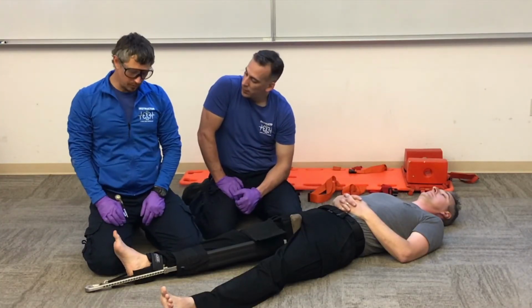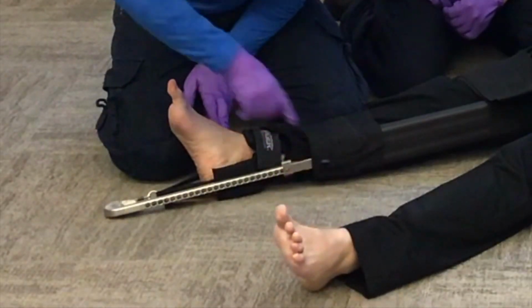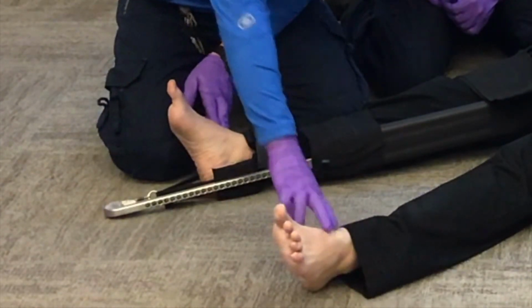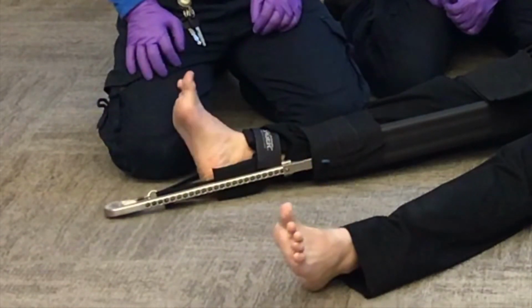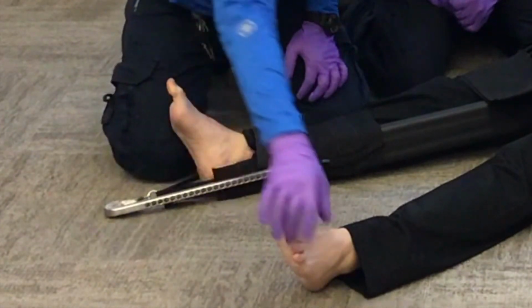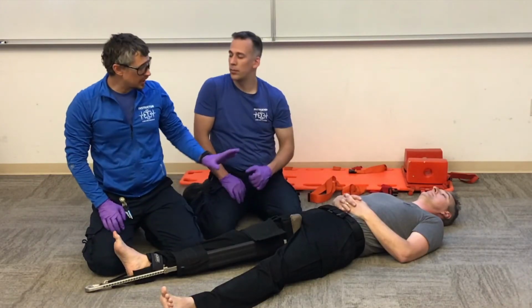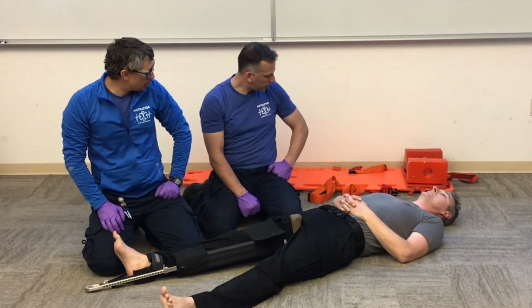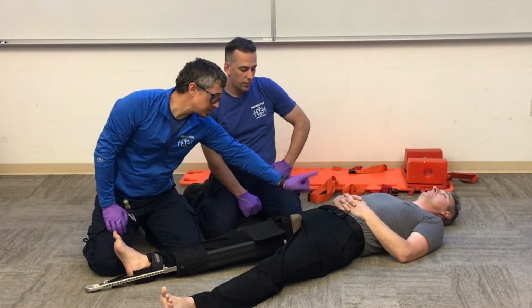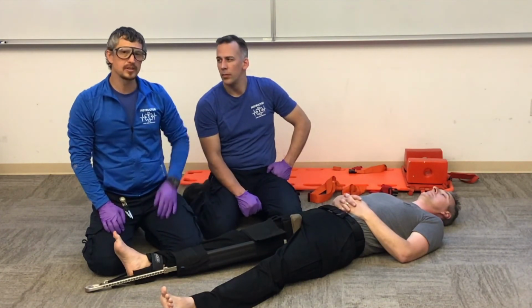Then we're going to go ahead and recheck our CMS. I'm checking the CMS on this leg, but also comparing it to the good leg. Chandler, can you wiggle your toes? Can you tell me which toe I'm touching? Big toe. Can you tell me which toe I'm touching? Little toe. Now we're going to take our patient, move him to the backboard, secure our patient to the backboard, also making sure we secure the hip and device to the board, and rapidly transport our patient.